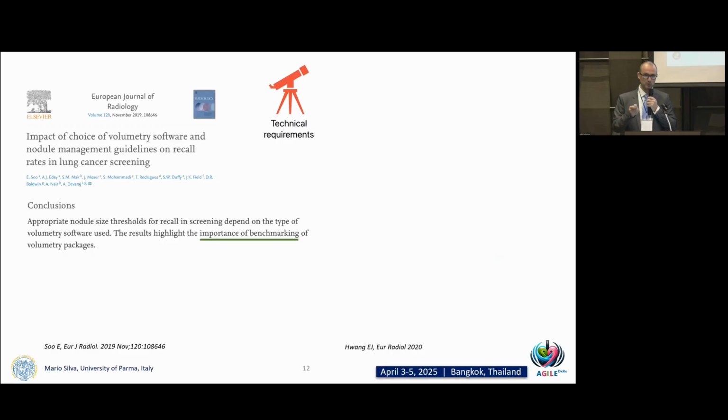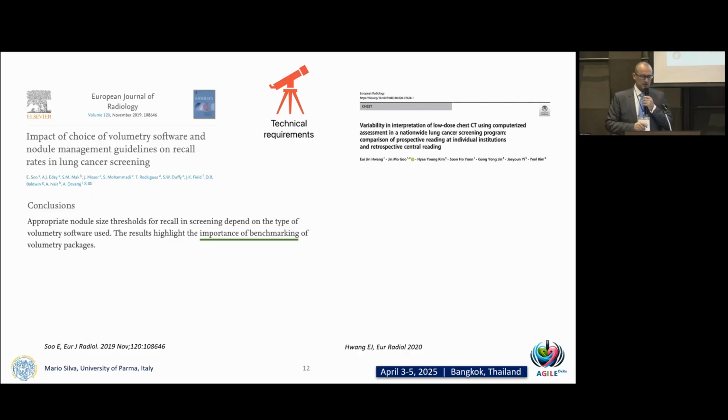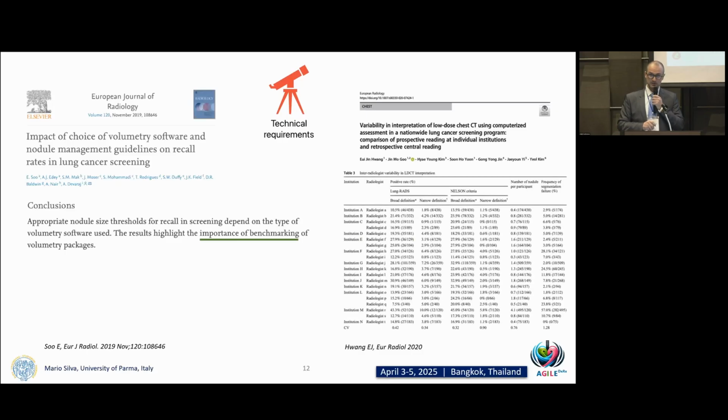So what do we need? We need a large database with clinical outcome for testing the software before it goes live. Isn't it true? Then we have the software that goes live, and we have humans using it. What's going on?